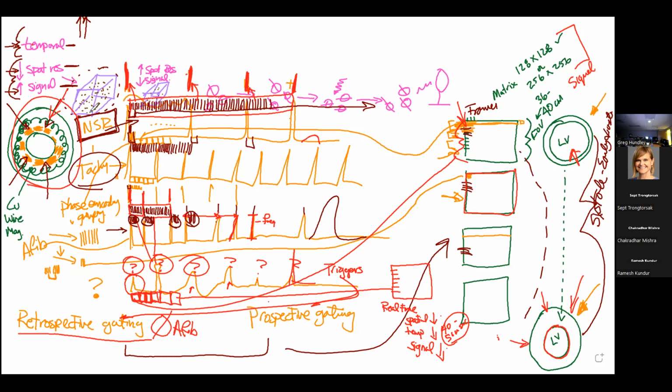Okay? So today, there's one more talk here about how we measure blood flow, and maybe I'll do that in about 5 minutes. But let's review. We're going to start with the purple and the pink up here. Last week, we talked about voxels and pixels and fundamentally how we're getting the image up here in pink, and we talked about the spatial resolution and the signal to noise. High spatial resolution, less signal in the images, right?